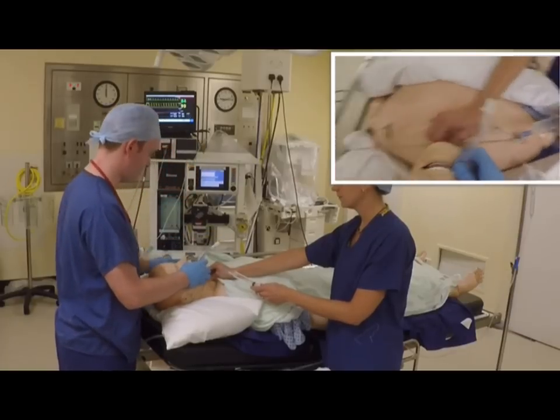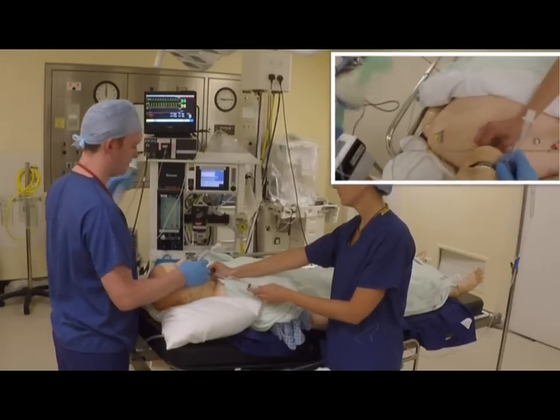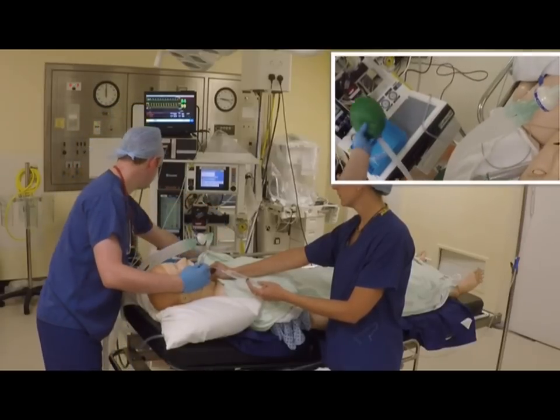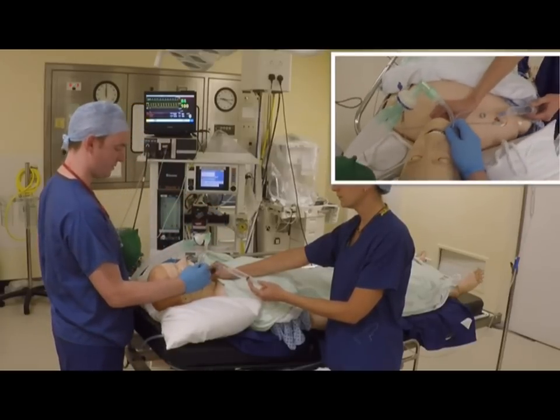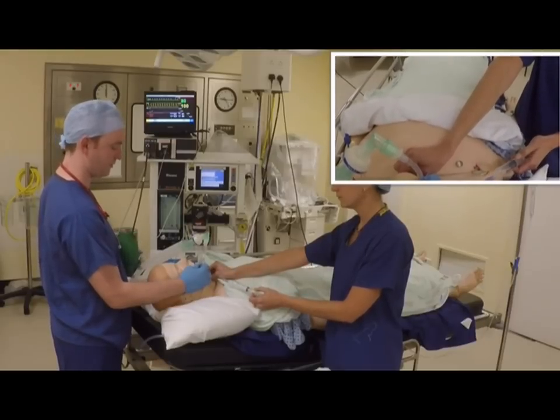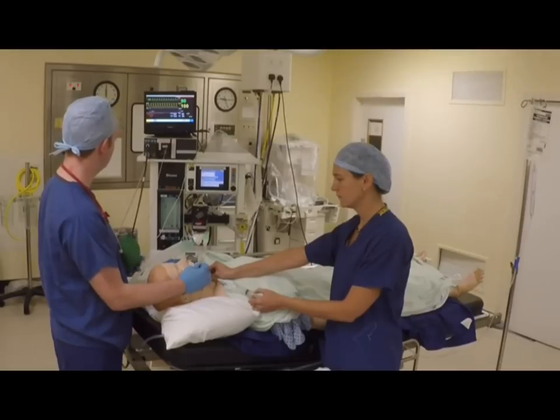Once the trachea has been intubated, air needs to be placed into the cuff of the endotracheal tube to ensure there is no leak around it, ensuring that no aspiration can occur. The position of the tube is then confirmed with equal chest expansion and with the presence of a minimum of 5 cycles of carbon dioxide.